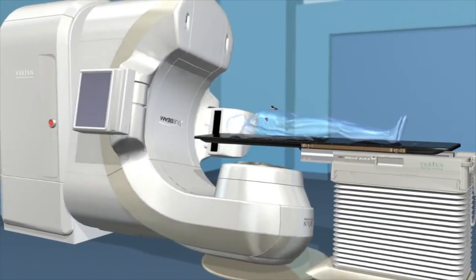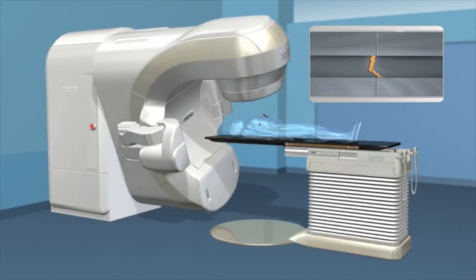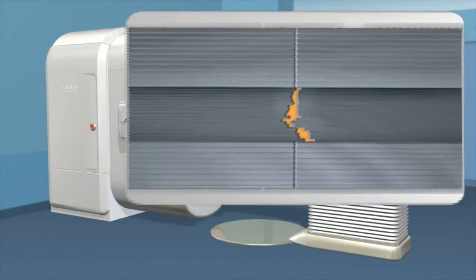The advanced guidance system, along with precise dose sculpting, are two of the most important advances in radiation therapy treatment.